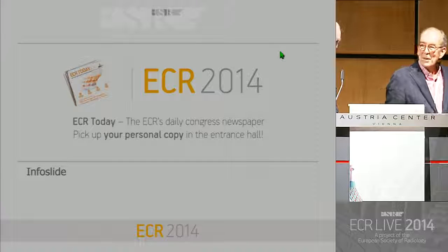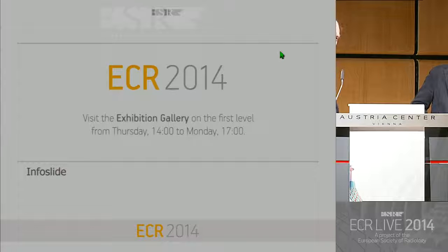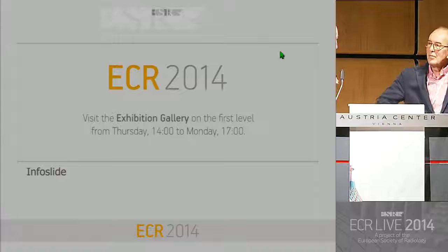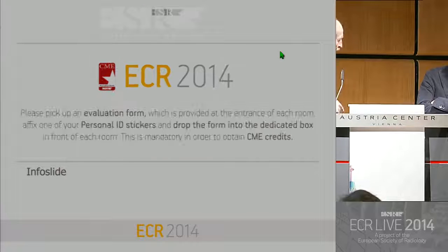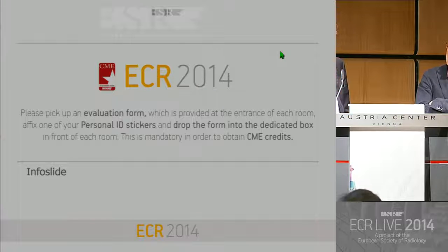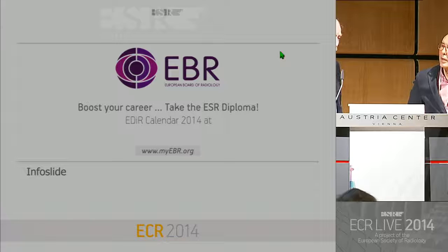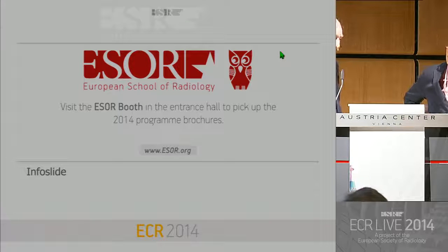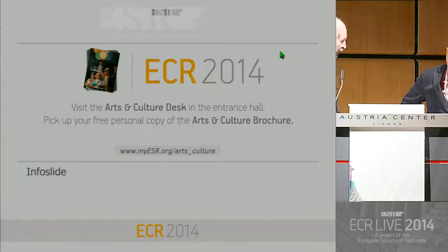I'd just like to express a couple of limitations that we see at the moment that would prevent us from using the MRI in the way it is recommended. The paper by Hafner was cited repeatedly by both of you. It identified 66 cases that were considered non-significant, no biopsy. But the routine biopsy found 13 aggressive cases in these 66.